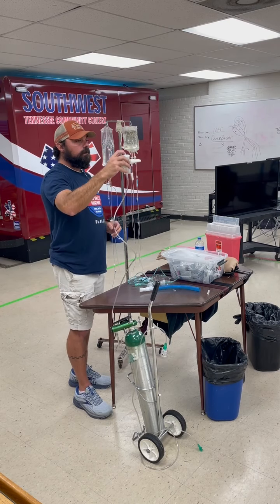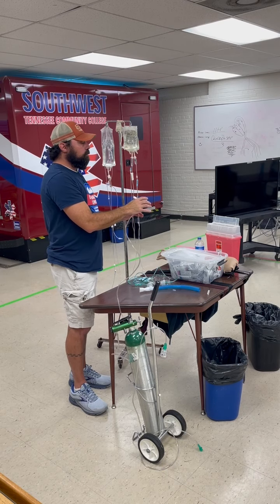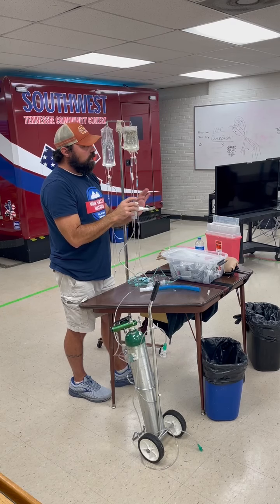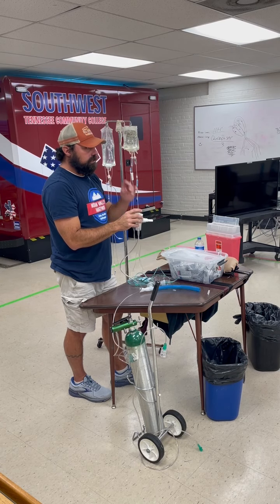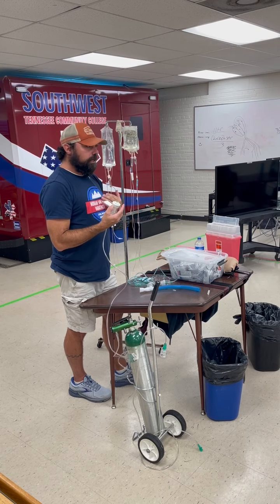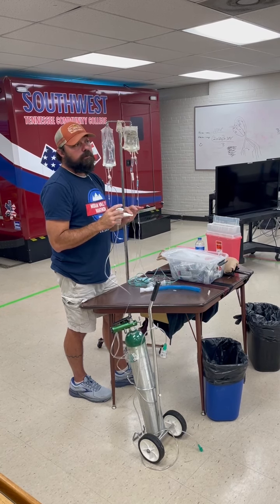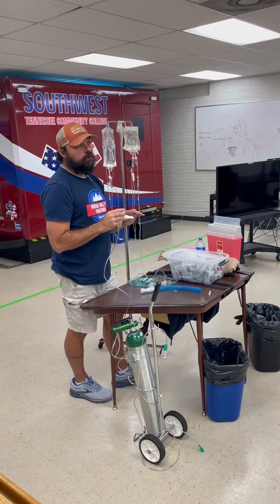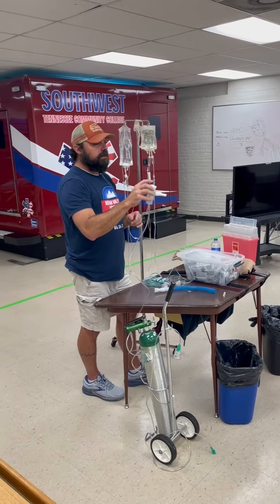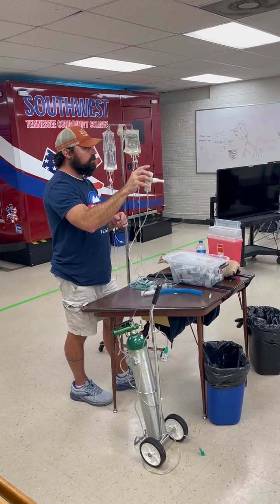All right. That's better. So these, if you have one of these little green button on top, the goal for this is that it doesn't waste the medicine. So the patient has to be strong enough to breathe in, and when they do, that knob will go down. I'm not going to put my mouth on this, Greg, 'cause I don't know where this thing's been. But I would show you otherwise. So you breathe in, and the little ball on the top goes down, and then they breathe in the medicine like that. That way they're not wasting.